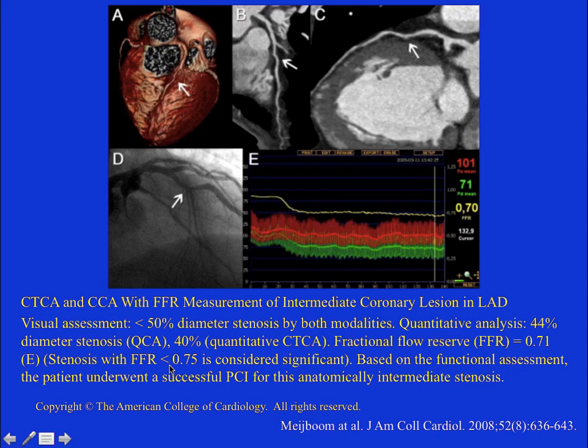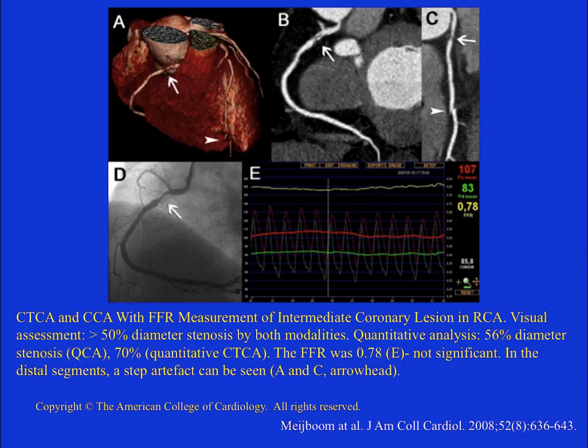is significant. So what does this mean? It means that an angiographic finding which looks insignificant clinically is in fact significant functionally. Again, emphasizing the fact that anatomy does not always equal physiology. Now we have another patient.